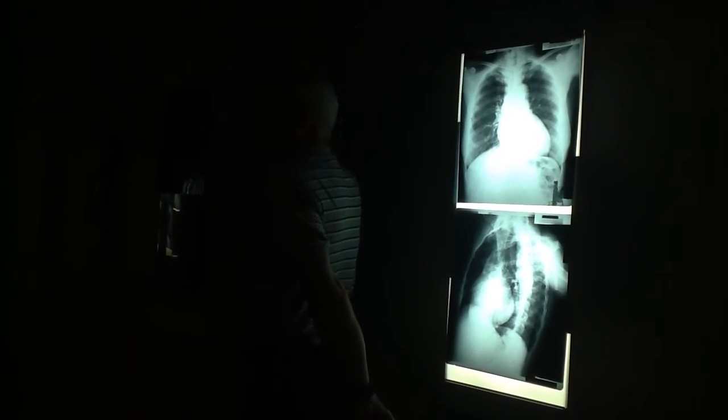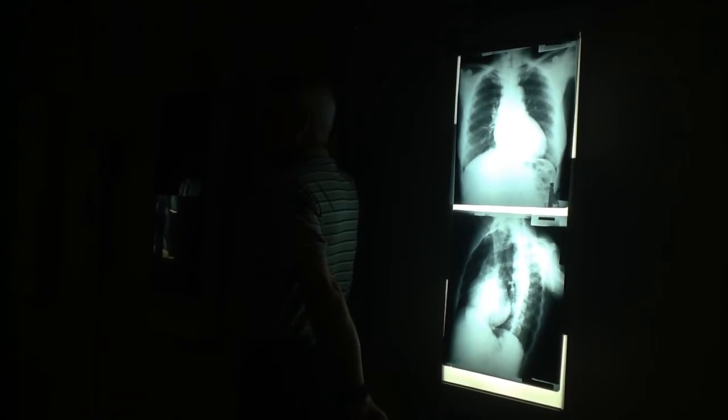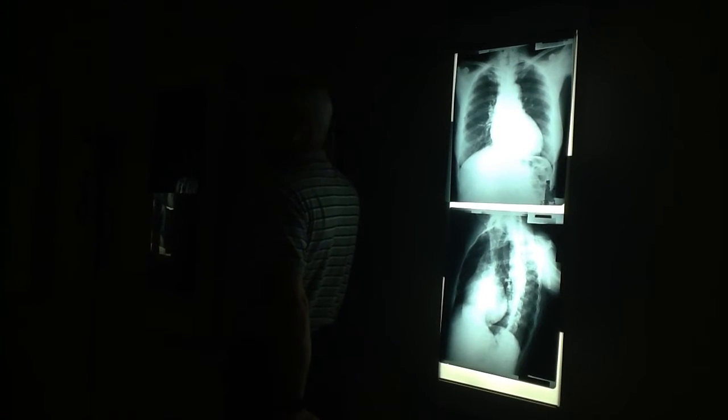So which way did we turn the patient? We're like this. Did we go this way? No, the other way around. You want the heart closer to the bucky. Which way did the heart go? Closer. To the right. If you go this way, you would see the entire arch of the aorta. So you need to go the other way around. That way.